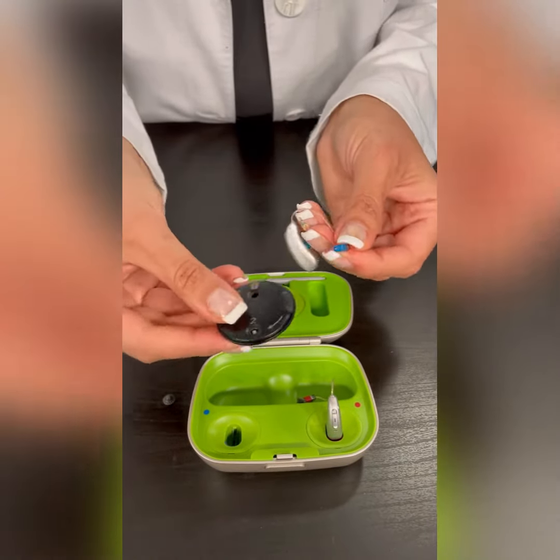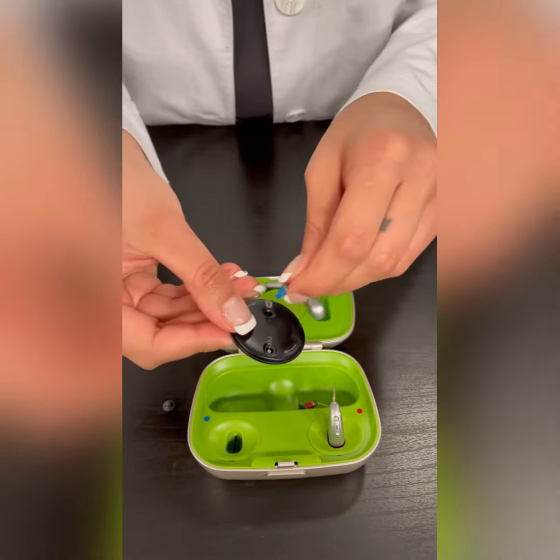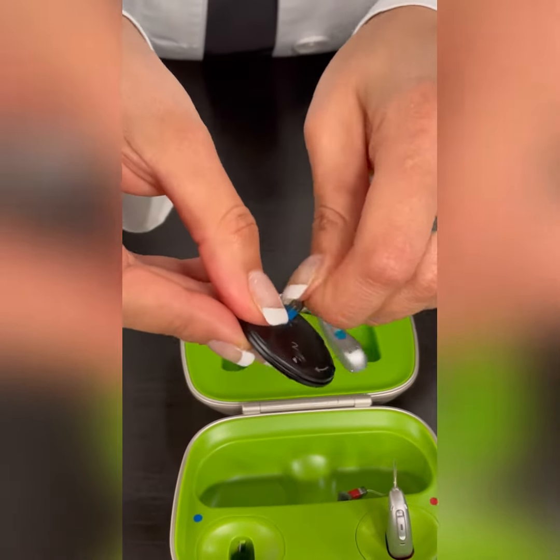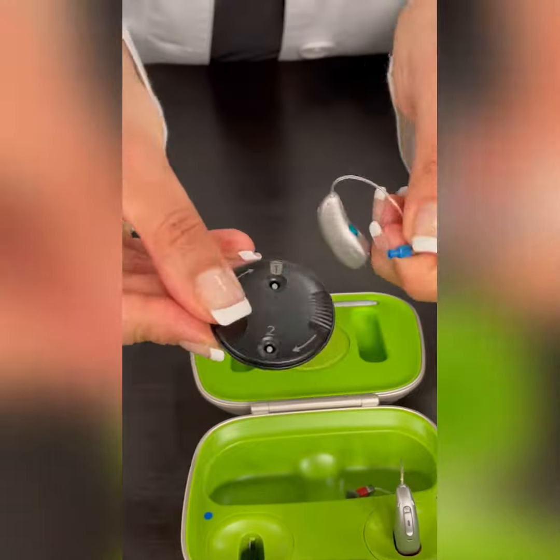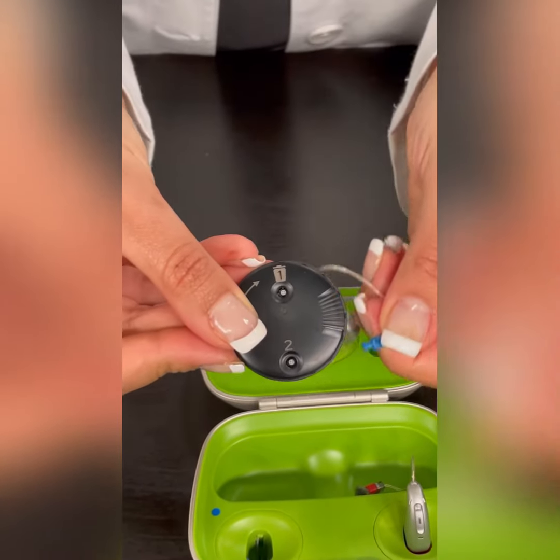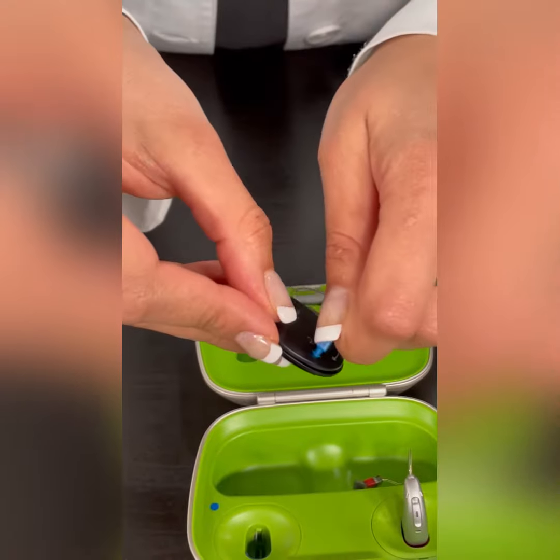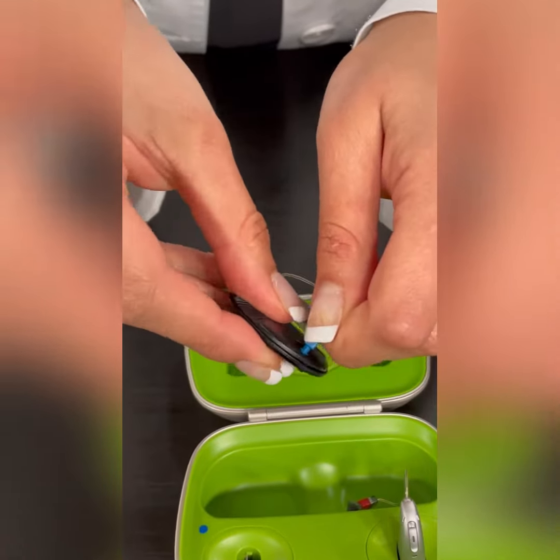What you'll want to do is push the receiver into the number 1 slot. This is removing the current filter. And then you will put the receiver wire into the number 2 slot. This is putting a new filter on.